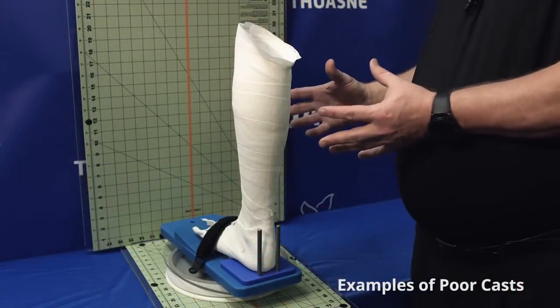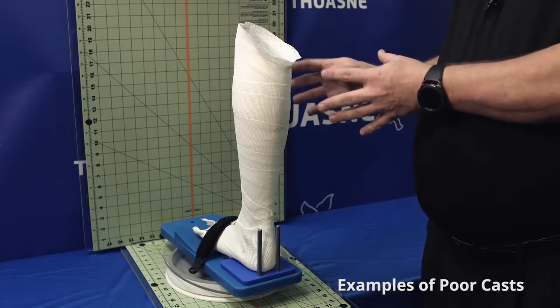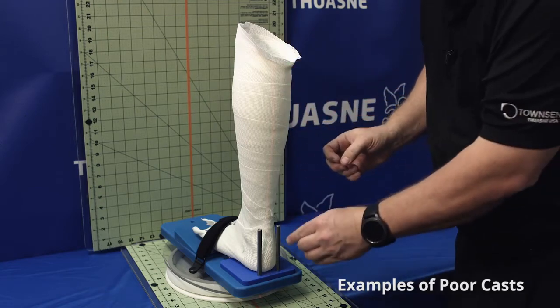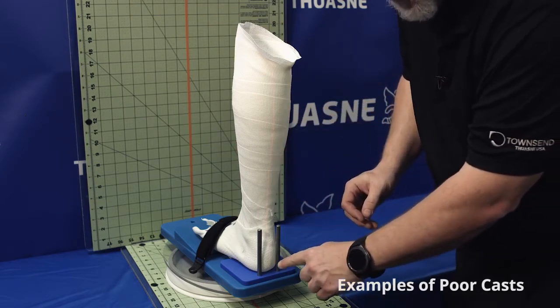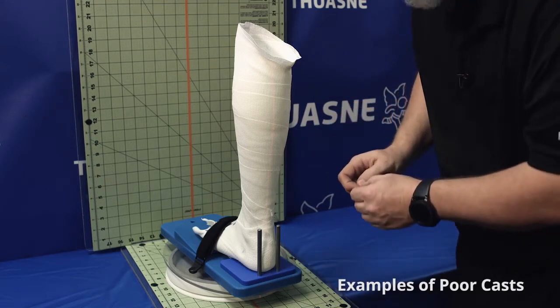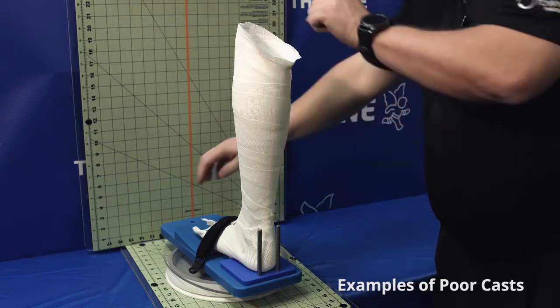This is going to be another example of a poorly aligned cast. In this particular cast, we're going to demonstrate that the sagittal alignment is actually pretty good, but the hind foot alignment and the forefoot alignment is not good. So looking at the plumb line, you can tell that the hind foot is in a significant amount of inversion, which is not indicative of what is on the order form.